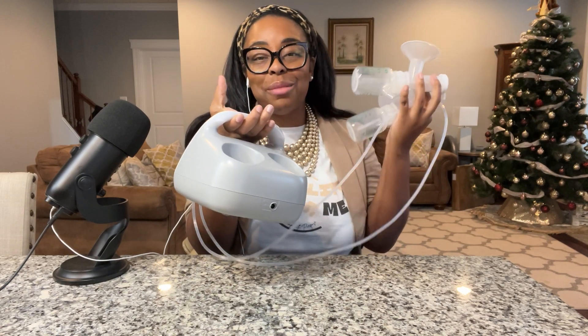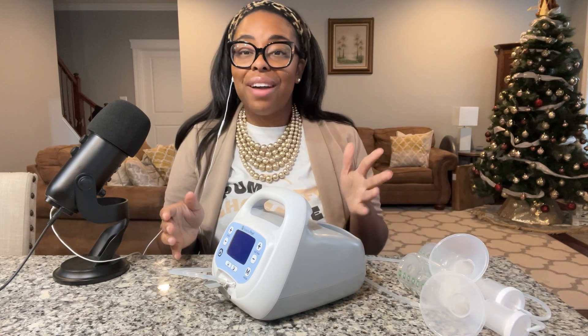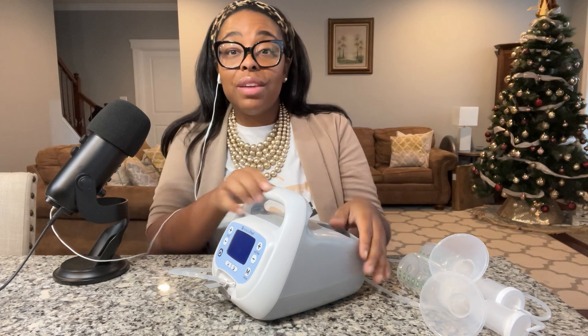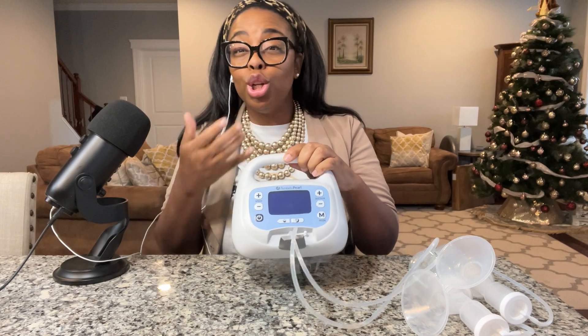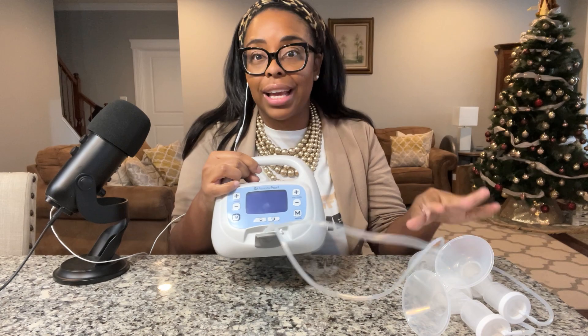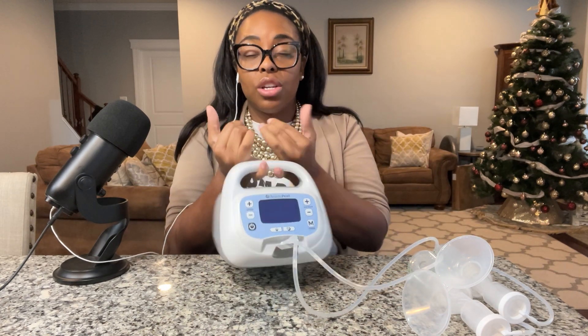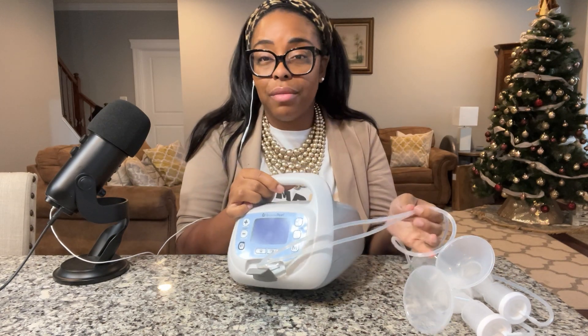The pump can hold both flanges and bottles inside of it. Even though it looks a little larger, I want to show you it has a little bit of weight to it, but it's not heavy heavy. I can't say it's lightweight, but it's also not heavy either — it's somewhere in between. I love that about this option.